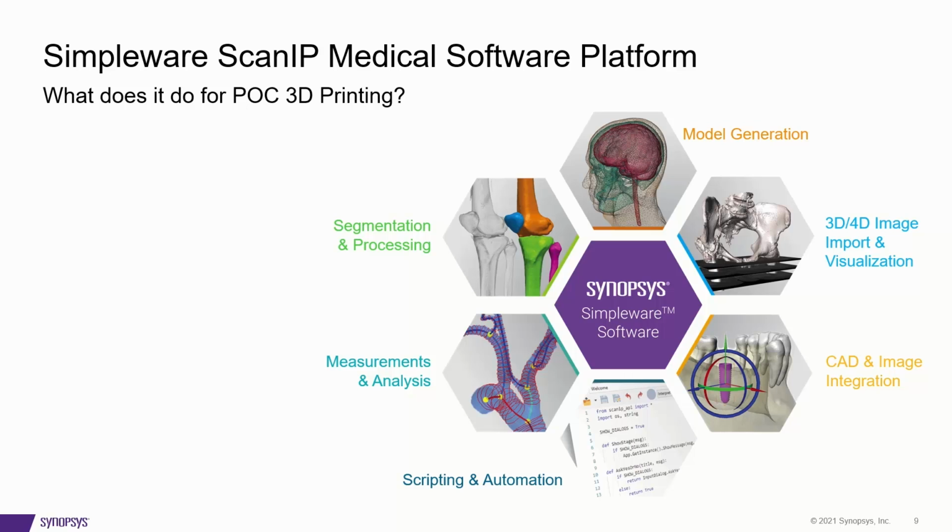This isn't up on the cloud. You don't have to worry about sending your data anywhere. It's all done locally, and it's put directly into the user's hands. There are different levels of customization that we can do for these tools. But I should mention also that the machine learning based AI tools are not FDA cleared. Everything else that I'm talking about is, just those AI tools are not. They're for R&D purposes only and would require a separate type of clearance.